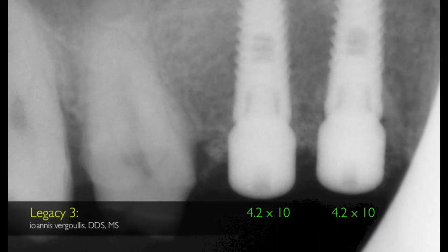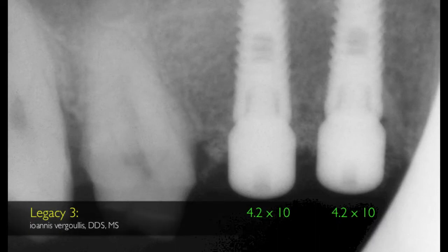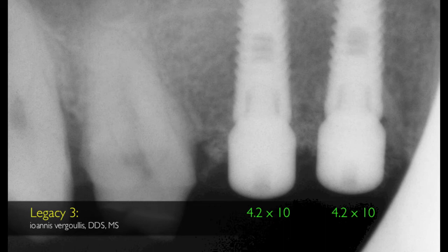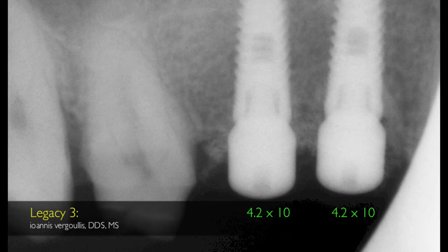Three months later we proceed with the recovery of the implants and placement of healing abutments, along with some hydroxyapatite material on the facial surface of the implants.